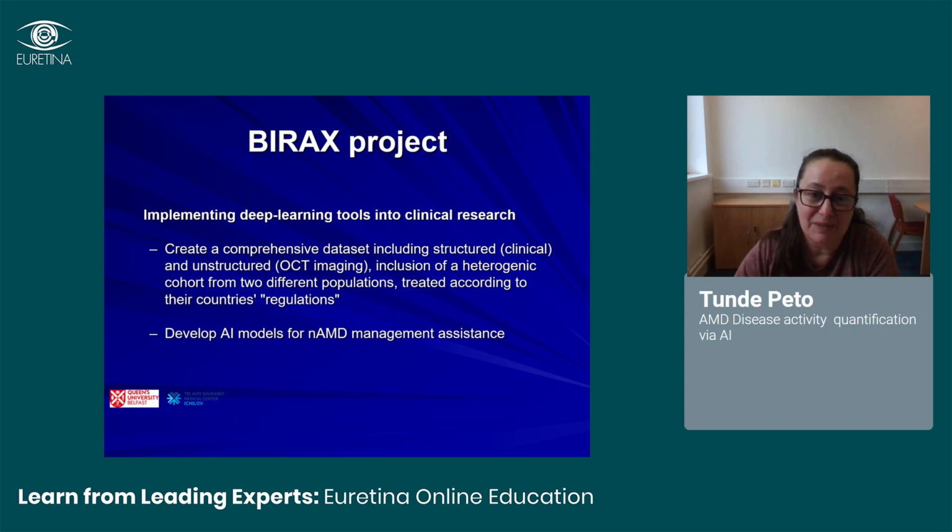So in the British Israeli project for AMD, we've been looking at how we can implement some of these deep learning tools into clinical research, by creating a comprehensive data set, including structured clinical data and unstructured data such as OCT images, and including a heterogeneous cohort from the two populations, treated according to each country's regulations.